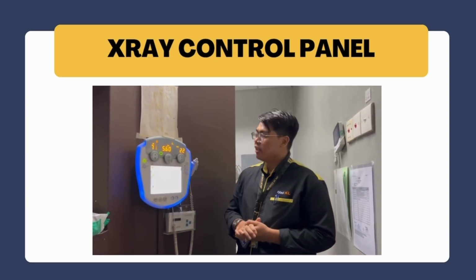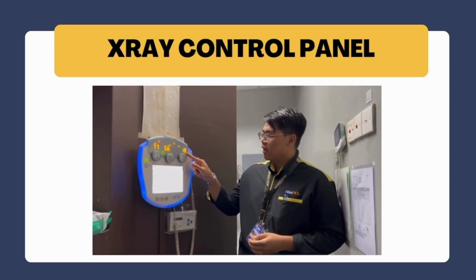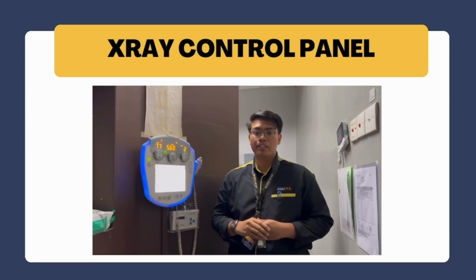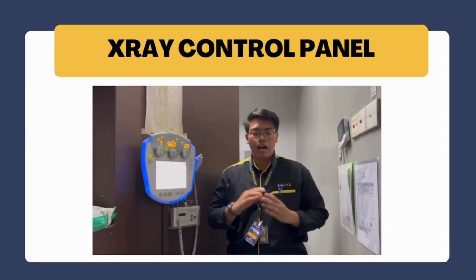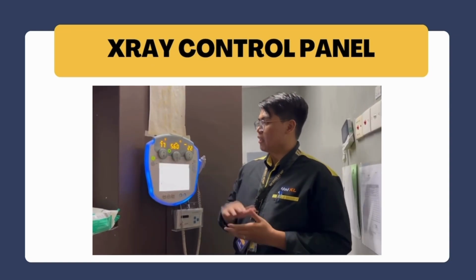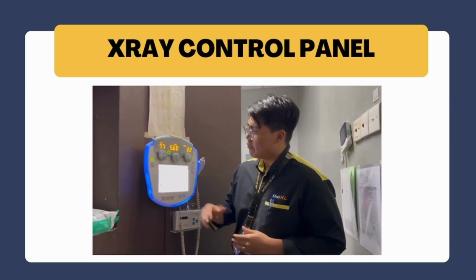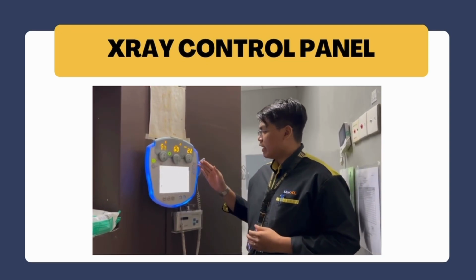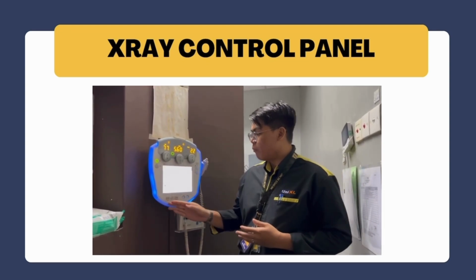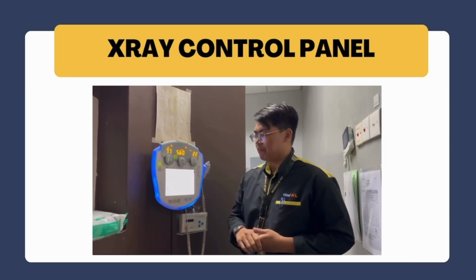After that, it also has the rotary dials. The function of the rotary dials is to minimize the time taken for one procedure. After that, the functional buttons here also have the on-off button for the X-ray panel. After that, the AEC button, home, lock and also setup.